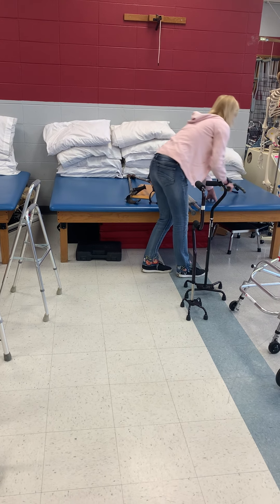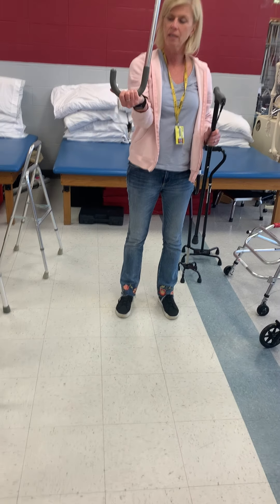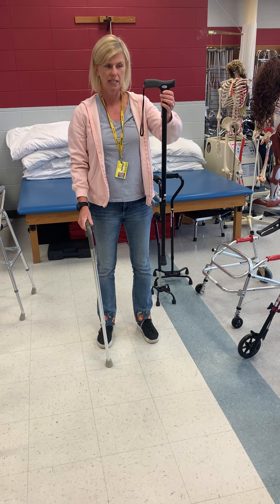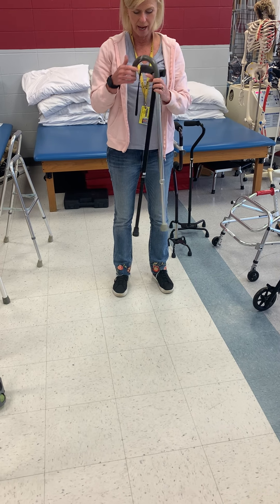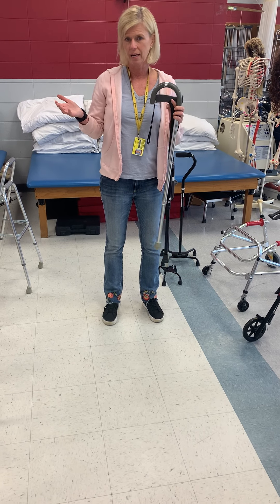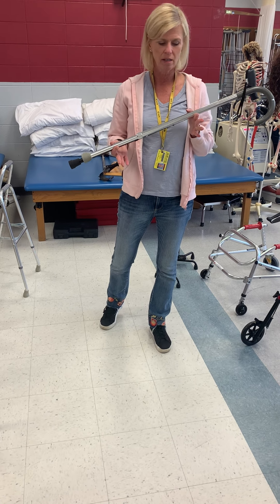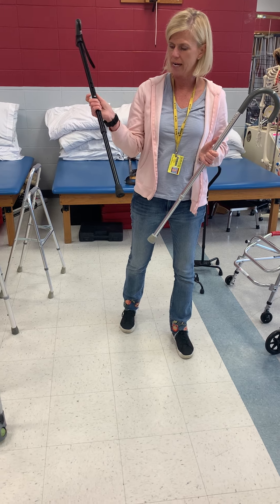These are my straight-line canes. This is called a J-cane because it looks like a J. And this is just a fancier version of a cane. They do have wooden canes too — the only thing with wooden canes is the patient has to cut it to length, and once they cut it that's it. These adjustable ones are relatively cheap and you can raise and lower them to whatever height you need.